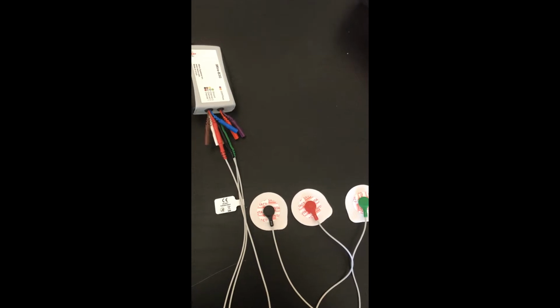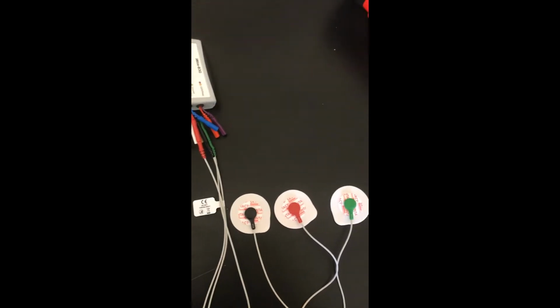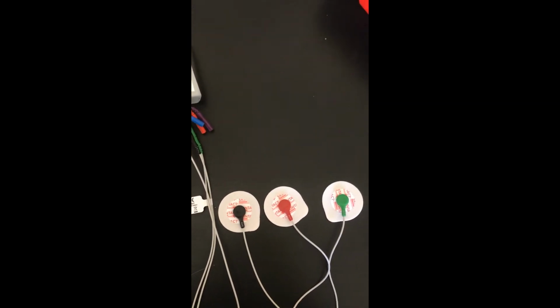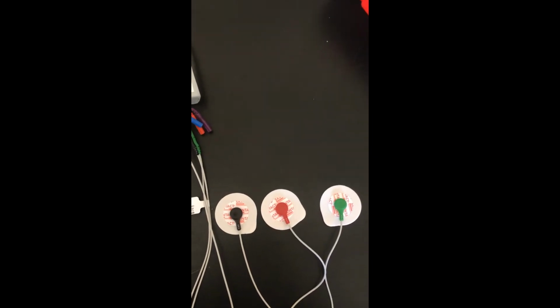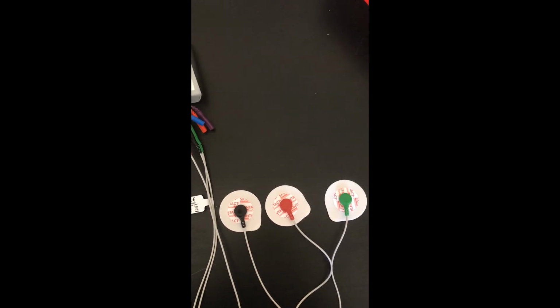I'm going to talk you through the setup for your ECG circulation lab. We're going to run three electrodes again for the ECG. You've got a red, black, and green electrode. The green electrode is your ground, and it's going to be located just superior to the right medial malleolus.